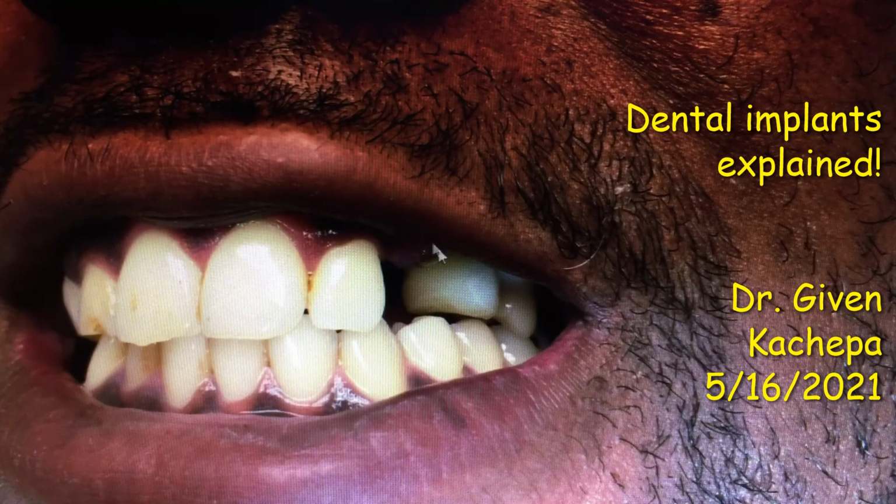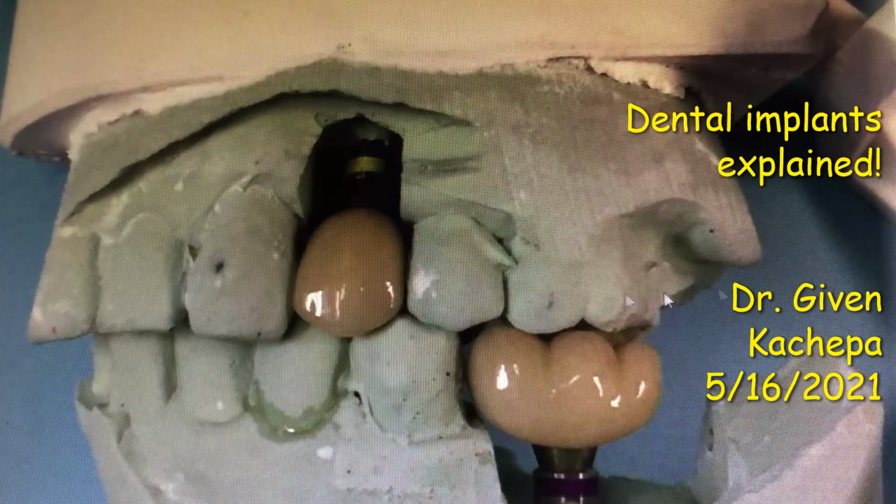Here was the buccal view again. This was primarily why they came in. They didn't like the fact that when they were smiling, you could see this. Now you can replace this. You could do a bridge here, a 3-unit bridge, but this patient didn't want that. They wanted an implant, so that's what we ended up doing in that case.